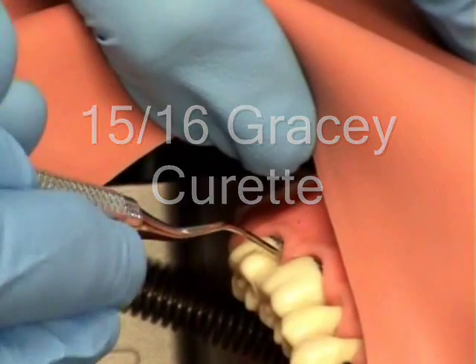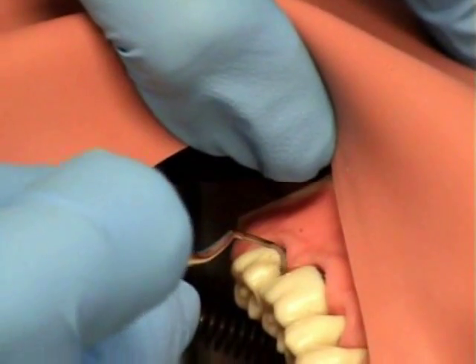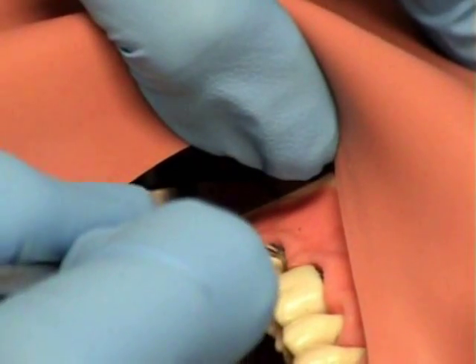When she discovers a deposit, she opens the blade, applies lateral pressure, and activates the instrument with a nice short stroke.